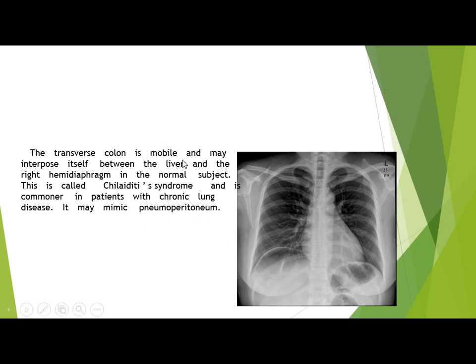Sometimes the transverse colon is interposed between the liver and the right hemidiaphragm, and this is called Chilaiditi syndrome and should not be mistaken for pneumoperitoneum.